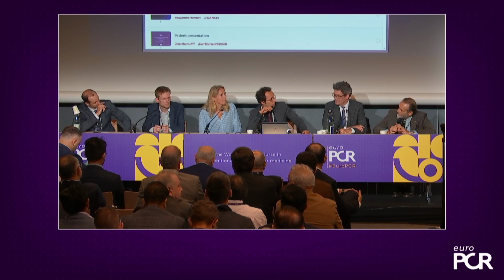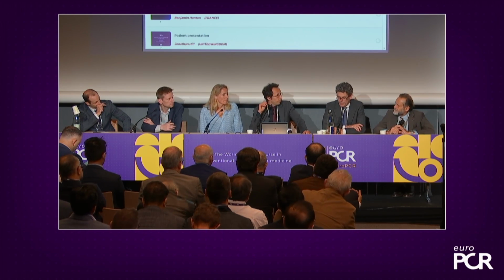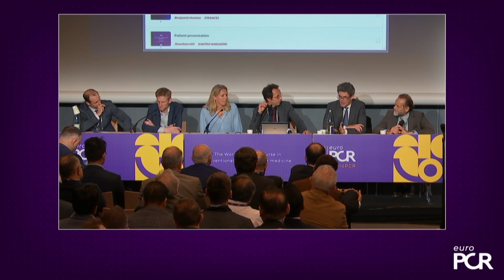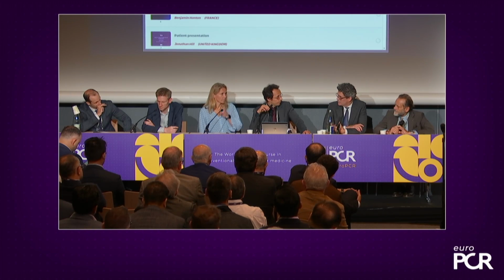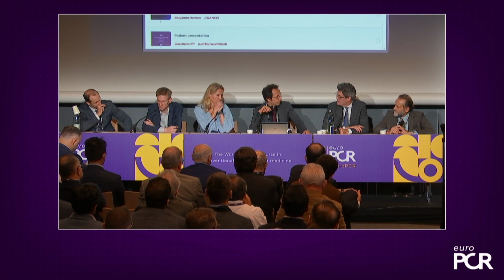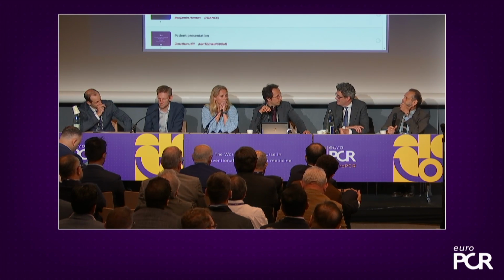Does it work, John? Sure. I think if you have your balloon expanded in the midsection of the balloon, in the most tightly constrained region where the concentric ring is, there is always sufficient energy being delivered by the proximity of the emitters either side. So certainly you get a double dose effectively.